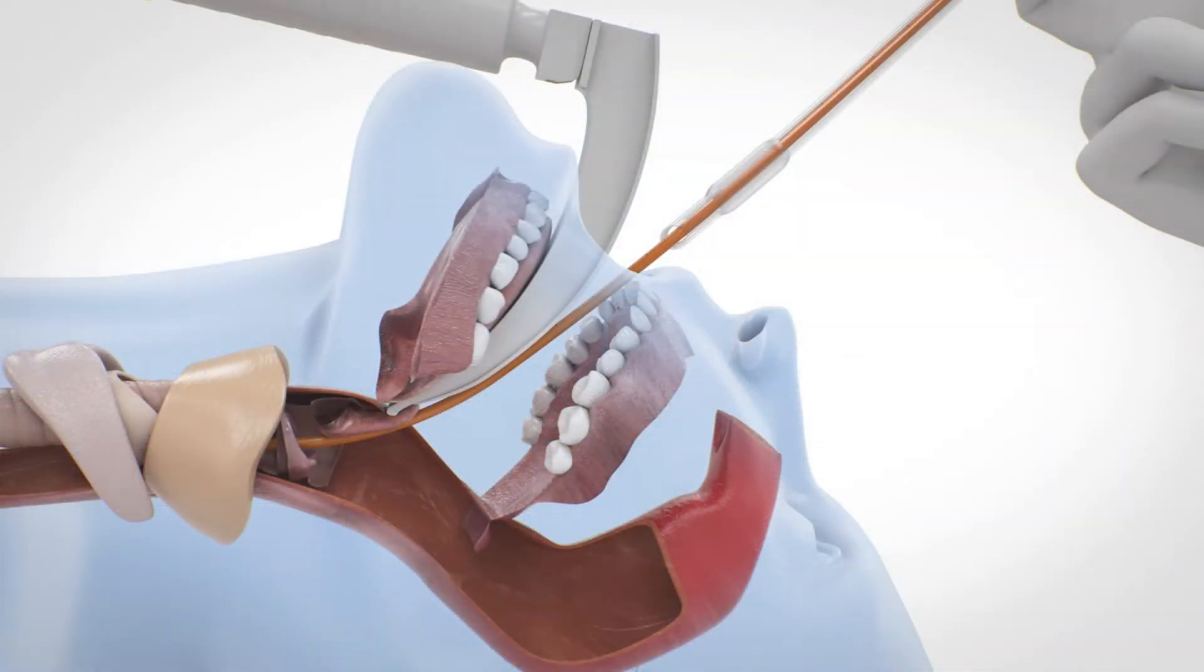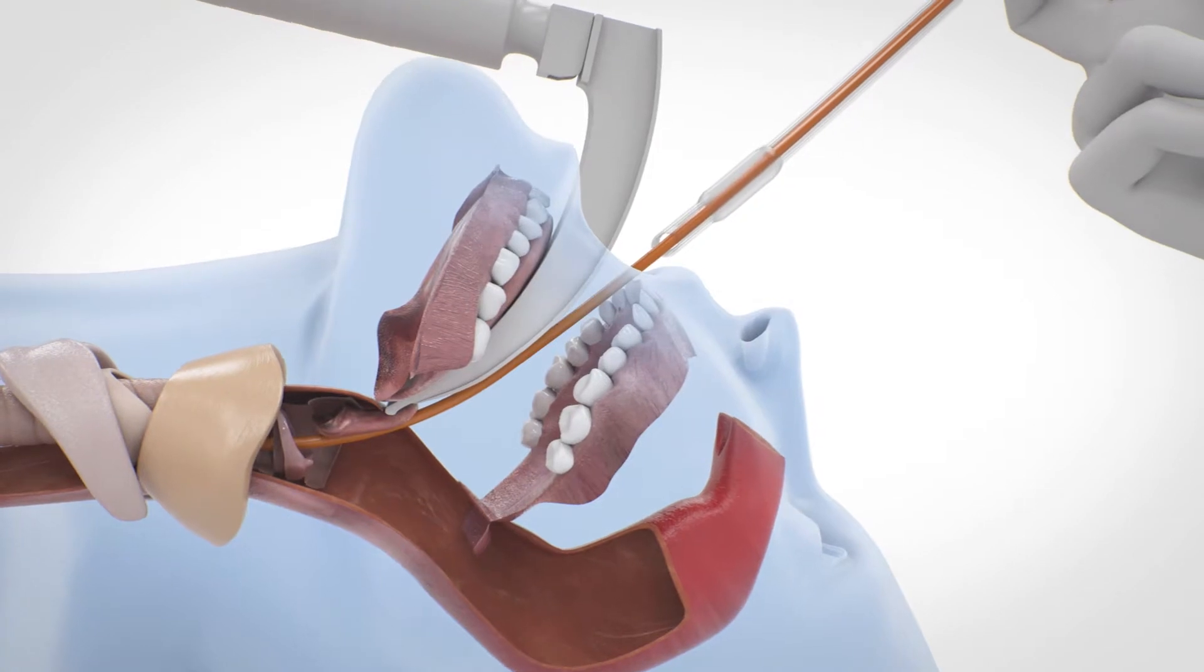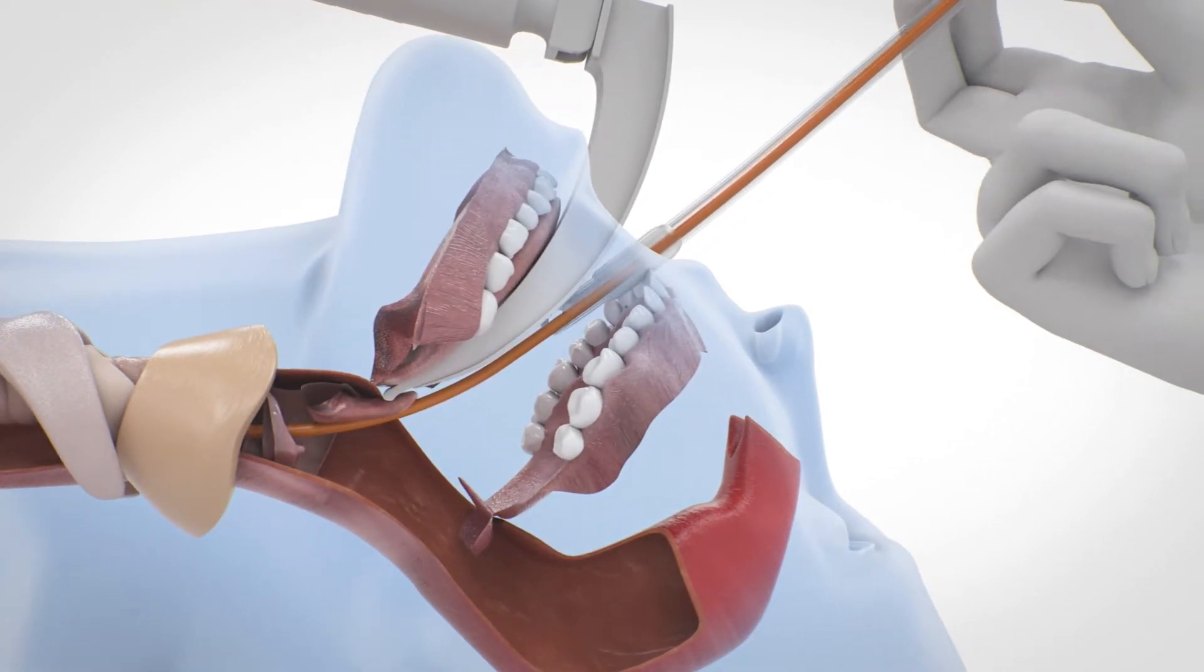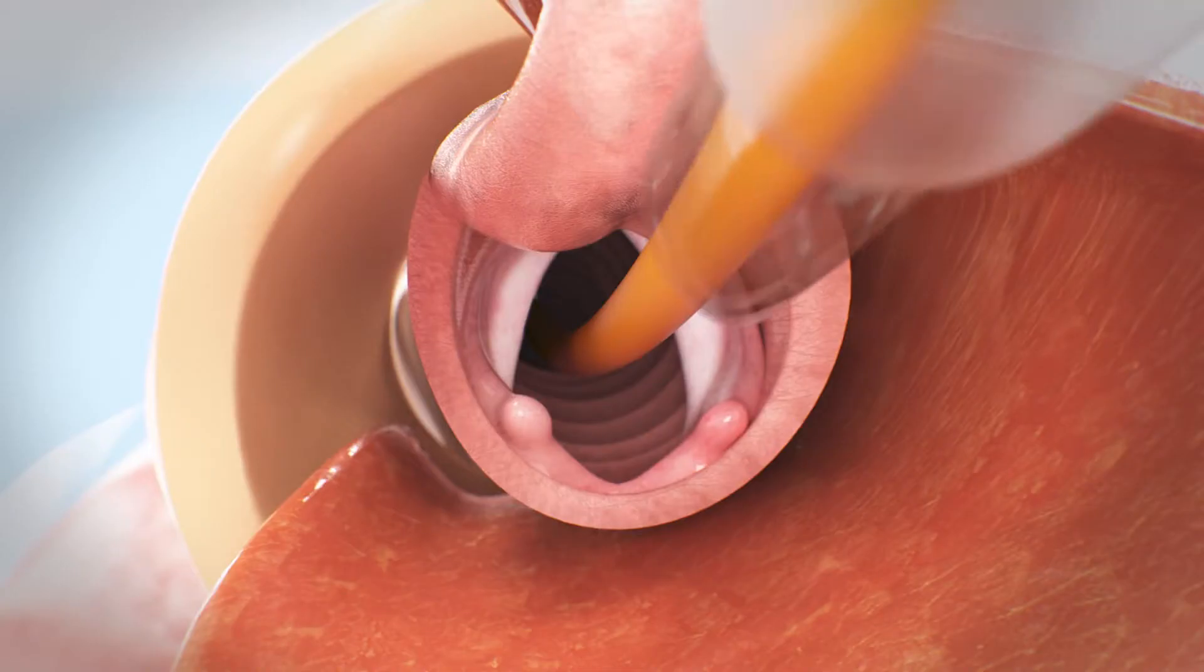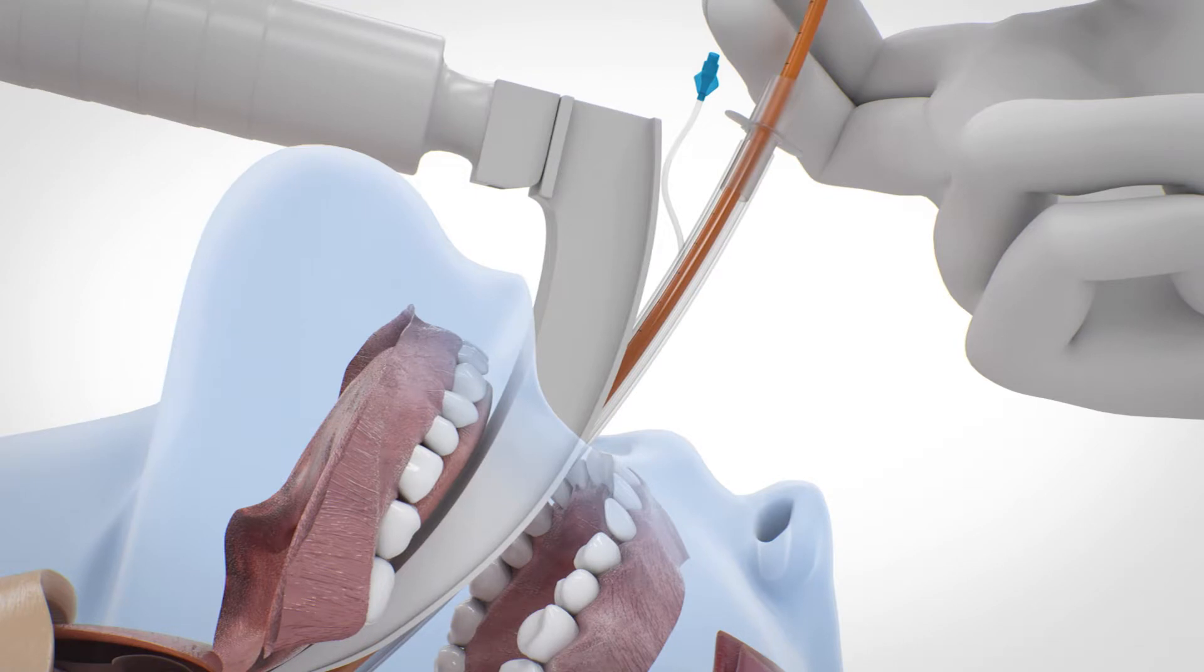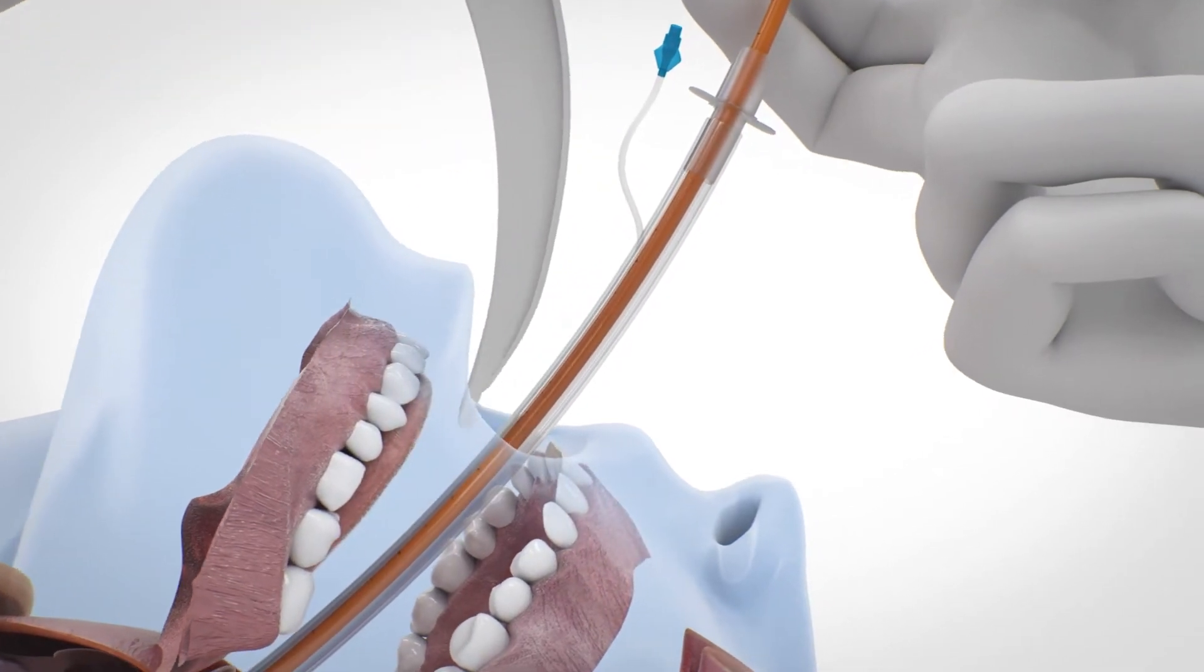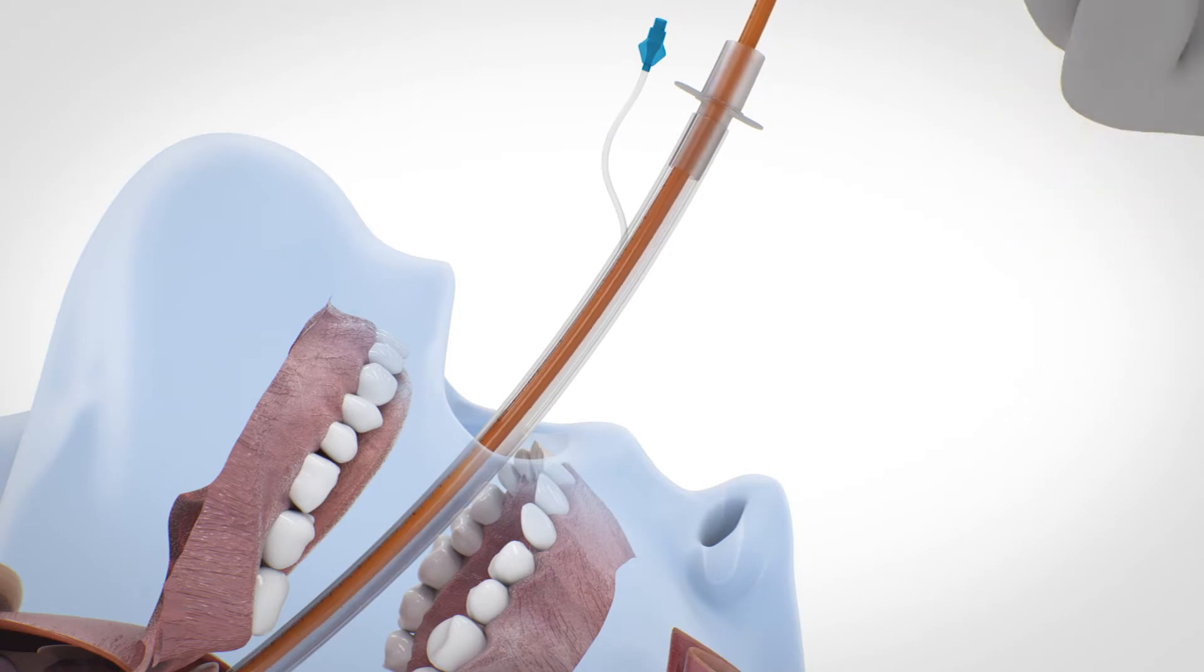After successful tracheal placement, maintain position of the EyeBougie and railroad the tube into the trachea. Maintain visualization of the glottis with a laryngoscope to ensure correct placement of the tube. Hold the tube in position, then remove the laryngoscope before finally removing the EyeBougie. Check for correct positioning of the tube by common procedures.